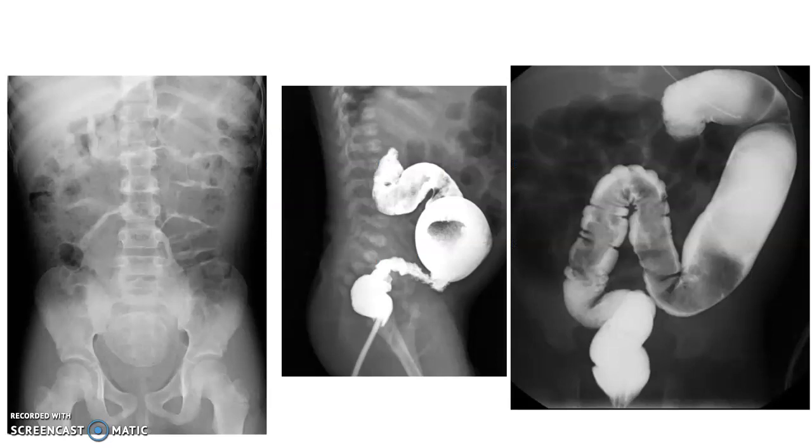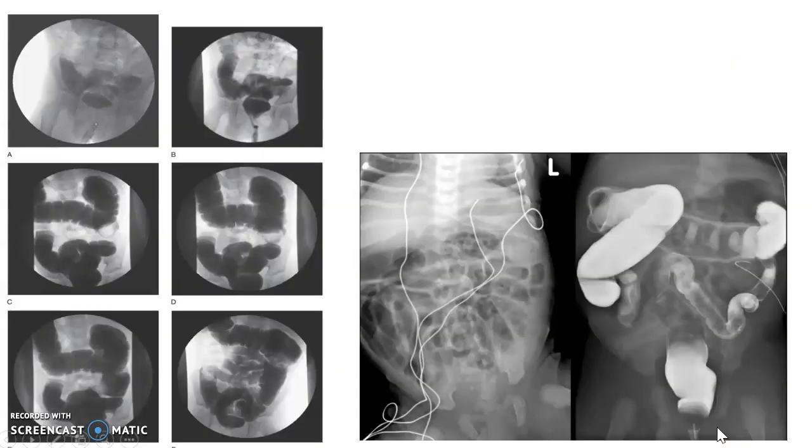Just an example here. So this child, if you can see this rounded area here, most likely rounded area of stool. There's stool within here. This sort of fuzzy appearance here is usually stool in the bowel. This is us putting contrast in, starting in a lateral position. You can see this is so big right here. Okay, this is a big expanded area. We turn the child supine, continuing to flow with contrast, finding any dilated loops.